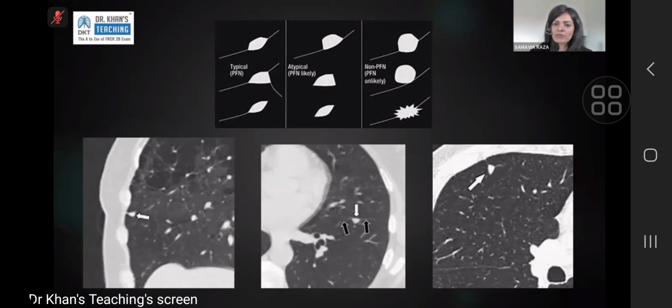What is not excusable is if the lesion was in the distribution of a lung lymph node, but the margins were clearly irregular. If the margins were irregular, or it was next to a fissure but looked like it was crossing the fissure into the other lobe, that's clearly malignant.